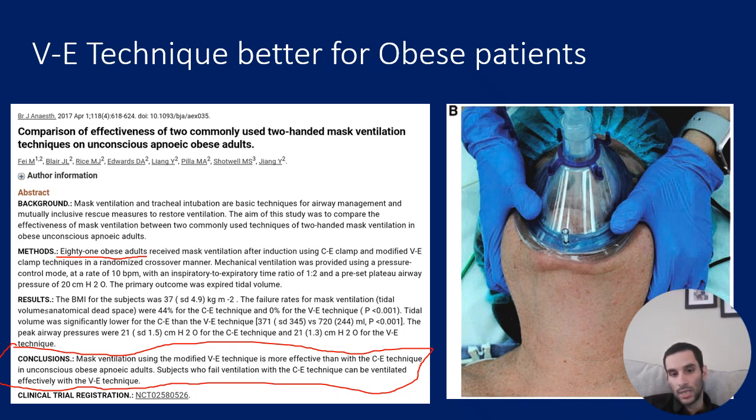So again, it's not just my personal preference. There actually is some research saying, hey, this VE technique is probably the way to go. So if you've never tried this or practiced it, I recommend trying it on a mannequin first. If you've bagged before, this is not that far of a jump for you. I recommend you give this a go. Try this out on a mannequin first and then see how you like it.